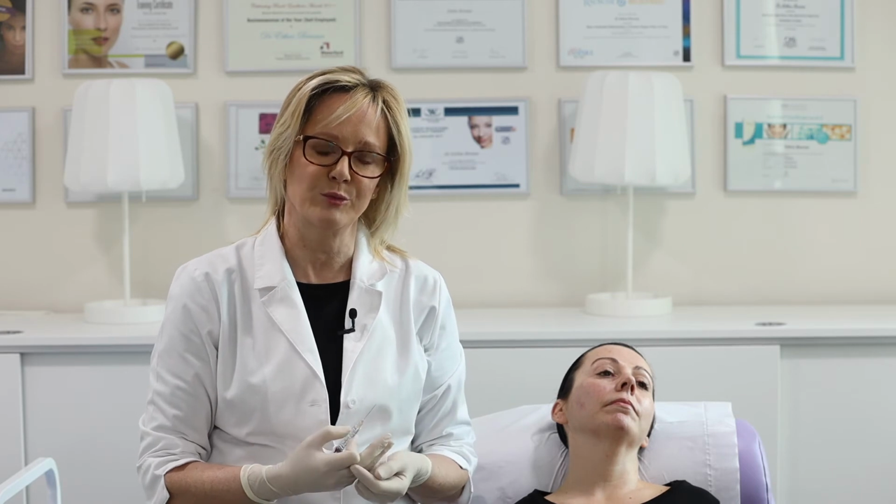And now I'm going to do the tear trough using Volbella. I'm going to be going quite deep with this, about 2 millimeters away from the orbital margin. I'll be protecting the eye with my non-dominant hand because safety is critical. I'll be depositing really very, very tiny droplets or micro-aliquots. I'll be doing it deep to avoid Tyndall effect, and I'll be doing it in micro droplets so that we don't get a sausage effect, for example, like a linear thread. So we'll go very gently. I'm using the same entry point, which is lateral to the mid-pupillary line, and we'll go nice and easily.